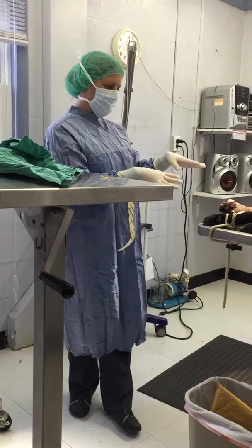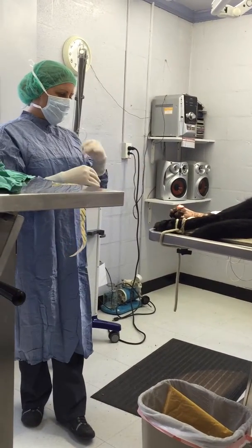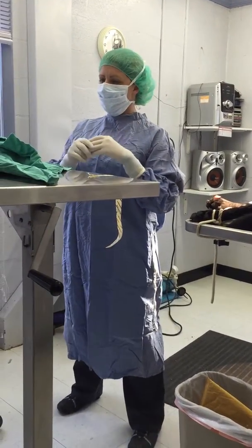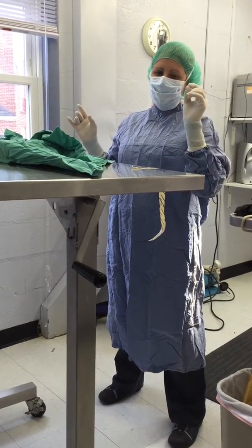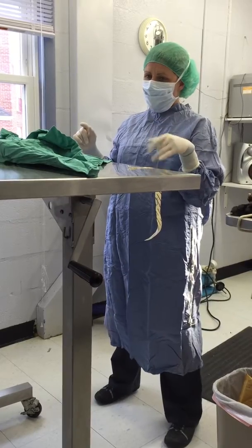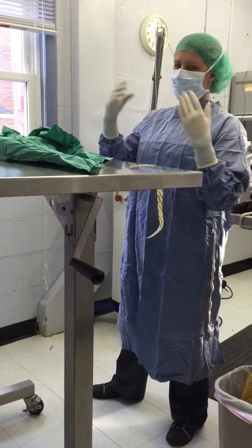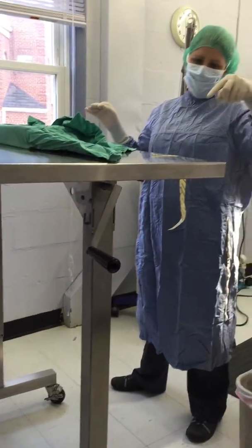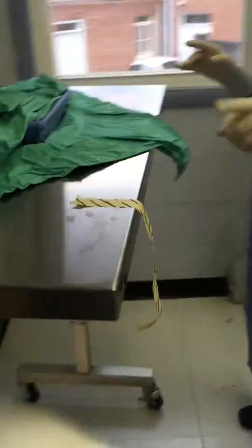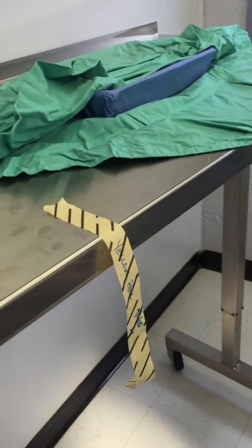I've already prepared our patient for surgery. I've scrubbed everything; everything's always wiped down. I've already started the opening of the pack. They open it in such a way that the last thing I do is they pull the last flap away from me. As you can see right here, we have our indicator strip saying it was in the autoclave.